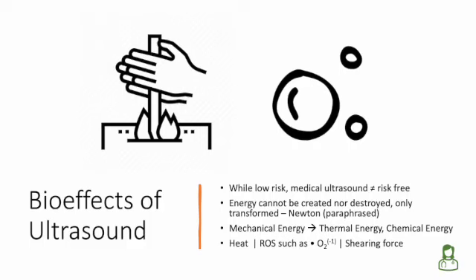This is important because understanding this helps us understand how ultrasound has the potential to interact with our patient, and it explains the bioeffects that ultrasound has been documented to generate. While low risk, medical ultrasound is not completely risk-free, and so it's important that we don't sell it to patients out of a duty to ethics, that it's not a completely risk-free exam, that there are some risks associated with it, but that the risks of such an exam are significantly lower than a lot of the ionizing radiation and other forms of imaging that we have available to us.